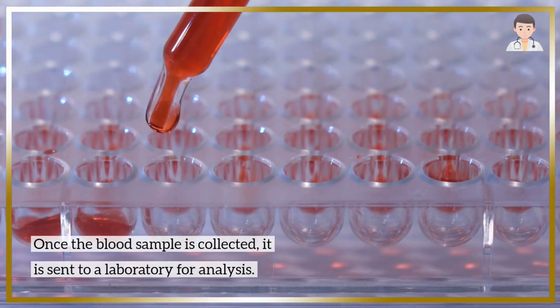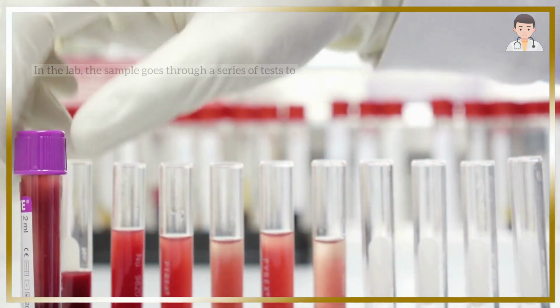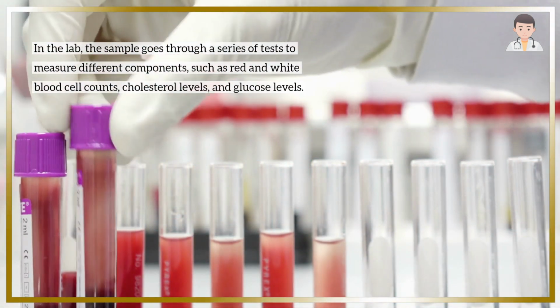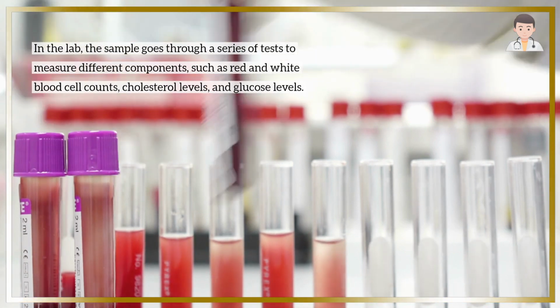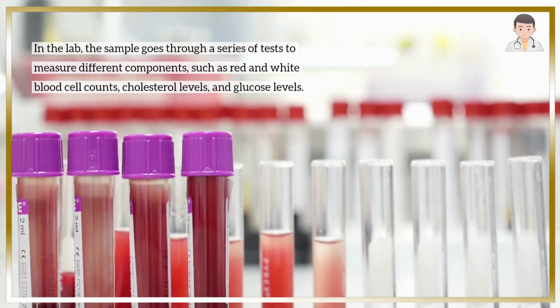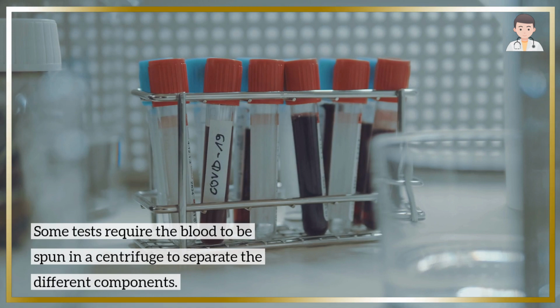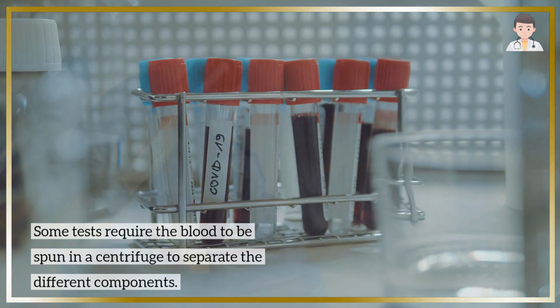Once the blood sample is collected, it is sent to a laboratory for analysis. In the lab, the sample goes through a series of tests to measure different components, such as red and white blood cell counts, cholesterol levels, and glucose levels. Some tests require the blood to be spun in a centrifuge to separate the different components.